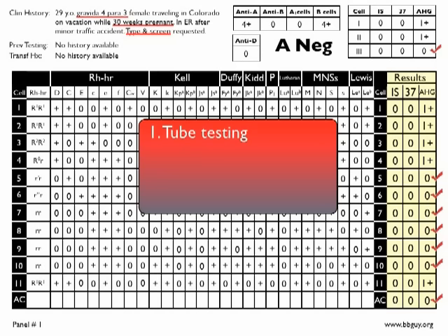The next thing that we always do, remember our basic process, is we check the auto control. Look down at the bottom right there and you'll see that the auto control is completely negative. That's great. That's good news. It allows us to interpret the rest of the panel without worrying that there are issues with that interpretation.